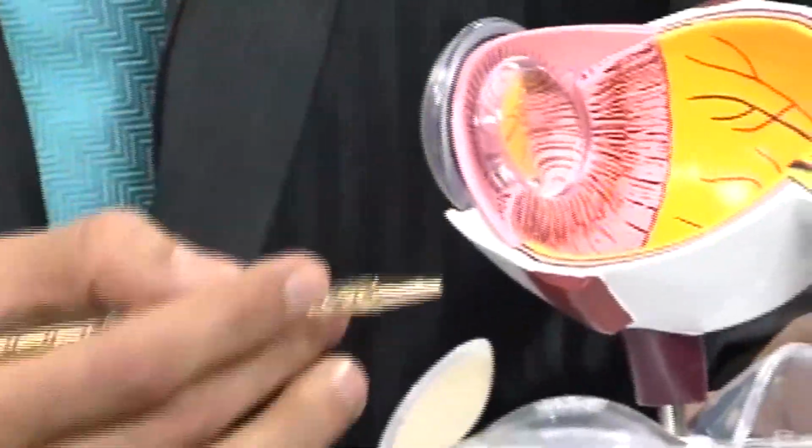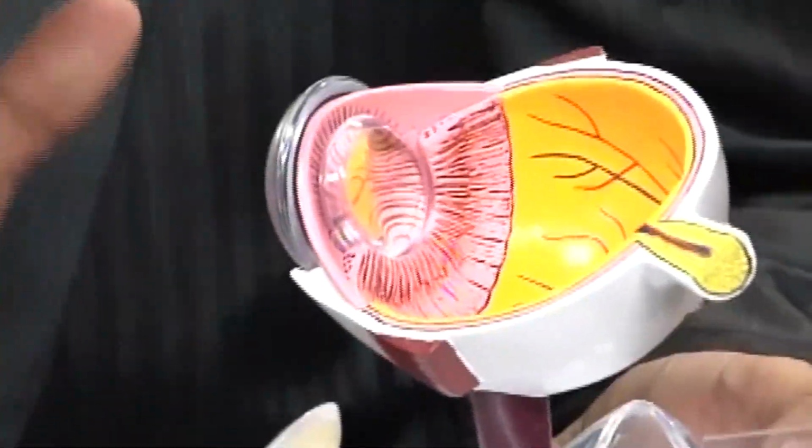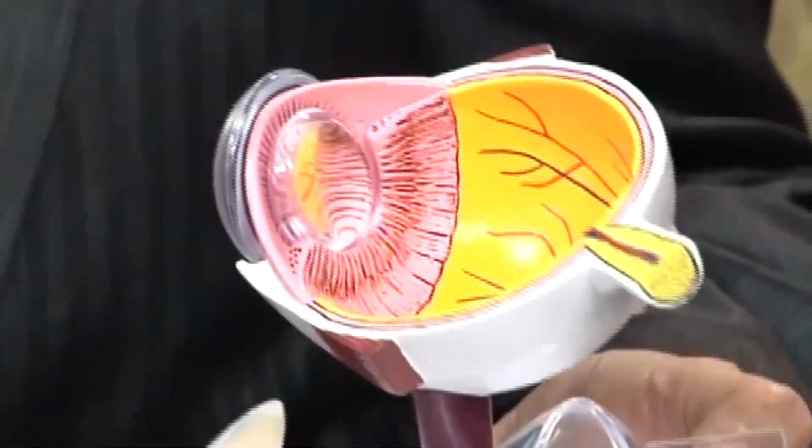So if you can manipulate the shape of this cornea, like in nearsighted people, you have to flatten the cornea. Farsighted people, you have to steepen it. And in astigmatism cases where they have a football-shaped cornea, you make it spherical like a basketball. That's what the laser achieves.